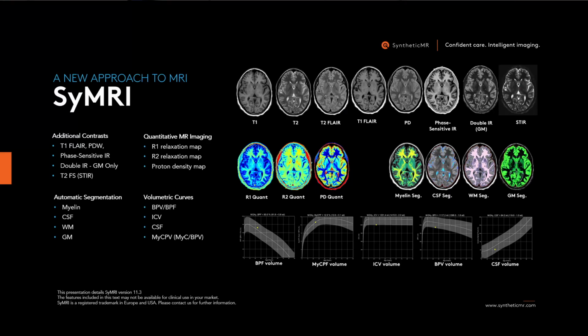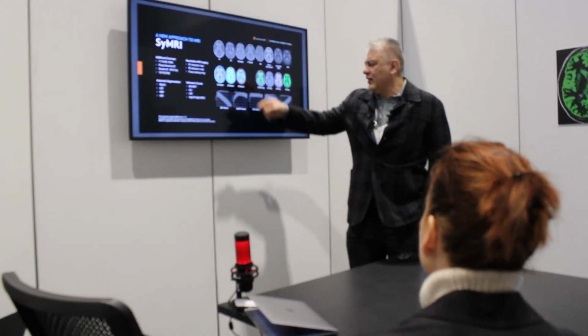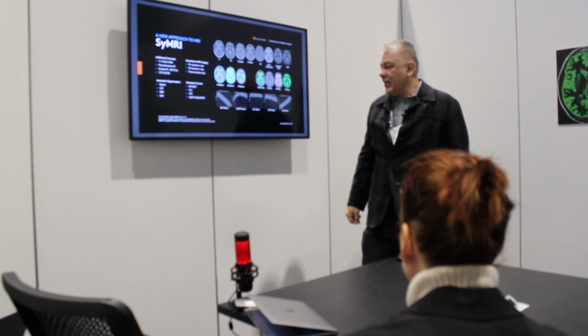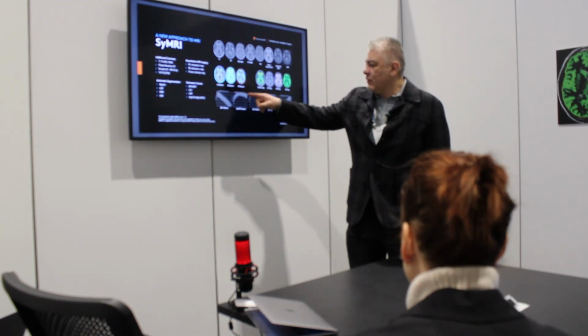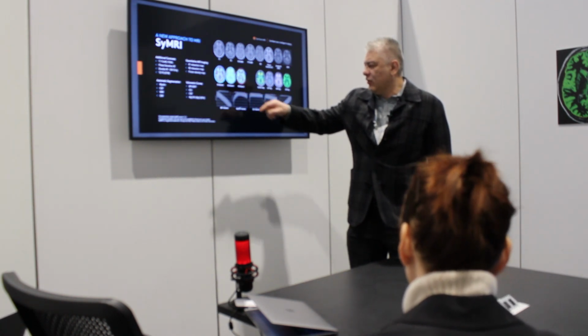On the same acquisition are generated all these maps. There are not only these 4, it's about 6 or 7. And all these values: R1, R2, proton density, T1, T2, and all these curves. And the curves are standardized by age. So the curve means plus or minus 2 standard deviations, that's where the yellow dot falls.